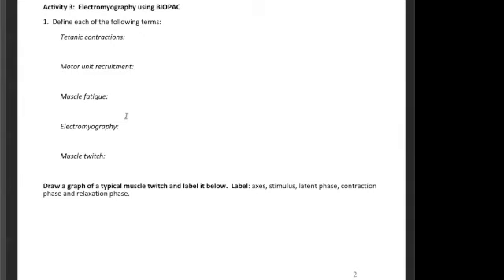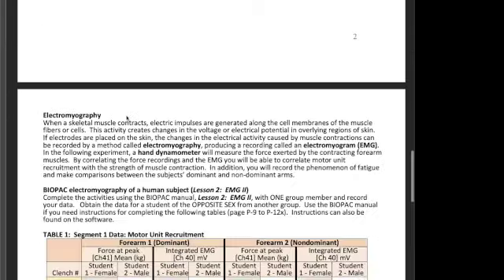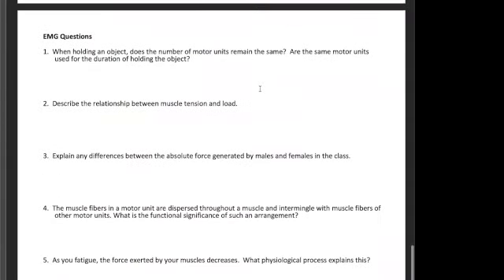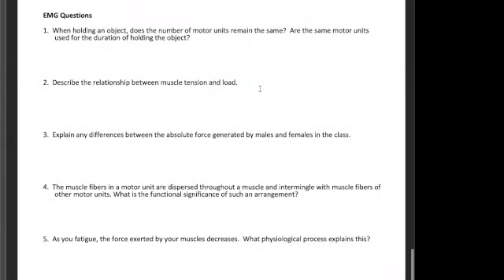I am going to show you now a video that Dr. Maroff and I performed in the lab with the BIOPAC software to show you how we actually went through to do that. Then I'll go through a little bit of the analysis and how you can fill out this table on your own. And at the very end, I'll go through just a few of these questions.